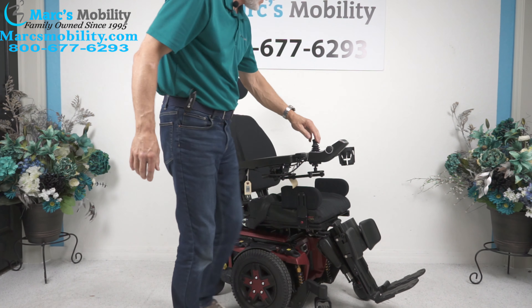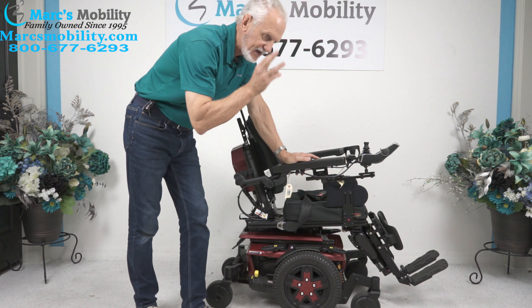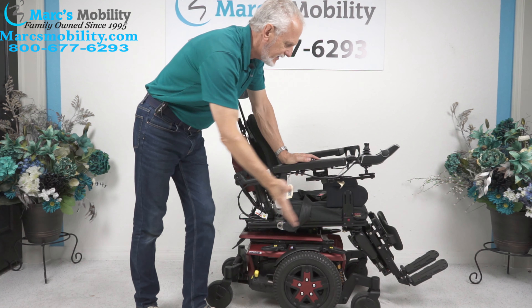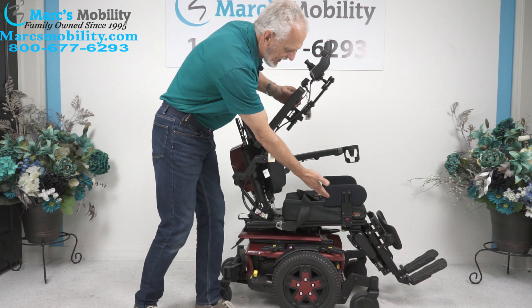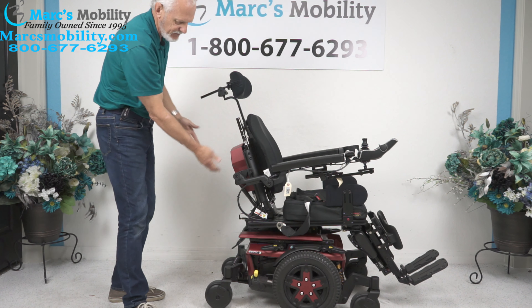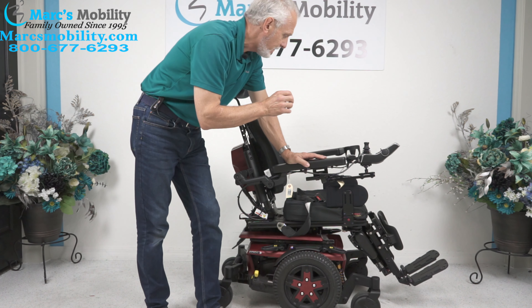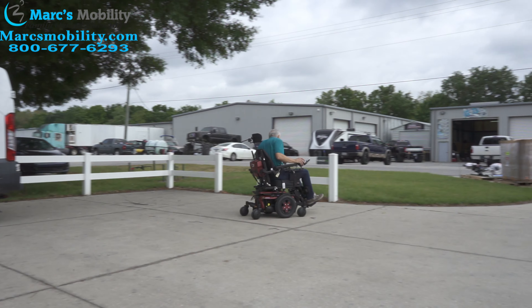So let's recap. This is a Quantum Edge 3, the latest in technology. It has three functions — electric tilt, electric recline, and electric legs. It has a 16 by 18 deep seat. It has the fold-up arm, the lateral pad, the safety belt, the swing-away joystick. It has an adjustable headrest that can be removed, Quantum suspension, the anchor points, and it comes with a charger. If you're looking for a really nice power chair, this is a great power chair.